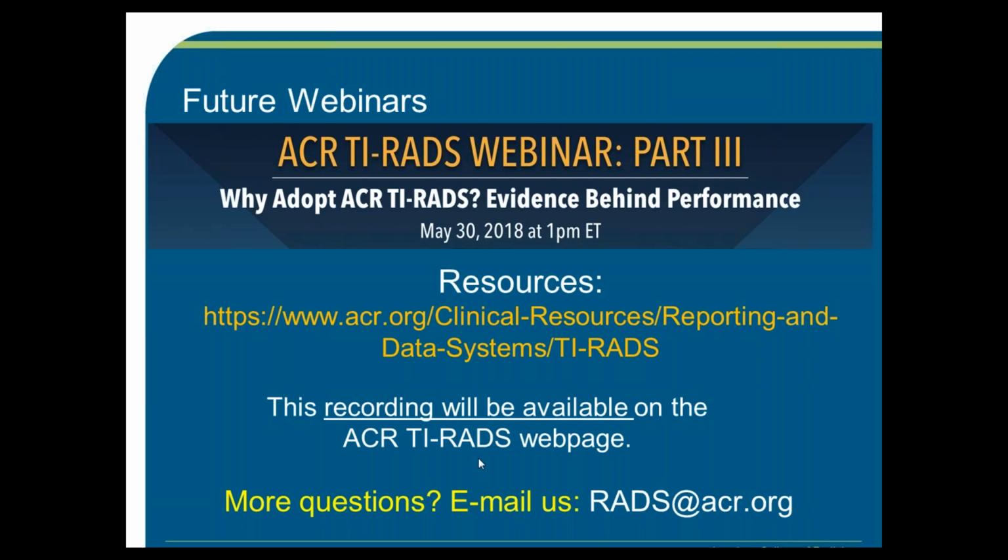In particular, I would be really interested to hear from you your initial experience, for the people that have started using ACR TI-RADS. Is it taking longer? How long did it take before your radiologist got familiar with it? Do you like it? And I, as a PI of the registry study, have definitely heard mixed responses. But overall, what I've heard is that for each individual nodule, it does take longer to apply 5 categories to the nodule, but because I'm not reporting as many nodules, it probably takes about the same amount of time, but I know I'm doing a better job and patients are getting more standardized reports and recommendations.